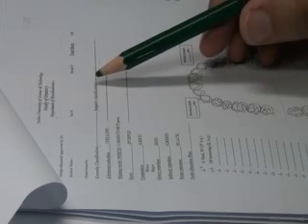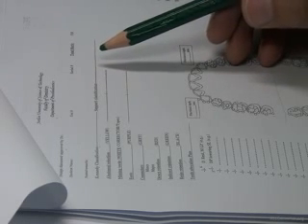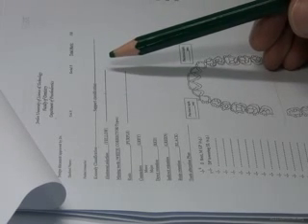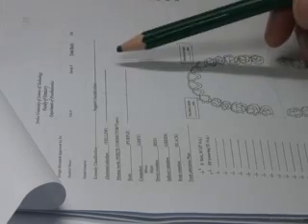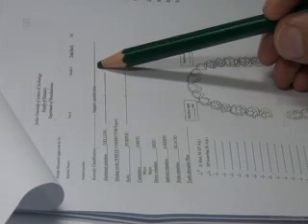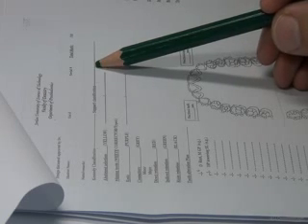The support classification is very important for you to understand, okay? And it includes taking into account the Kennedy classification as well as the length of the bounded saddles if they are present, okay? Because in long bounded saddles, there will be a shift in the support. Once you have a shift in the support, whenever we write down, for example, tooth tissue support, that means we are looking for stress-releasing designs for components, okay? We're looking for stress-releasing methods.